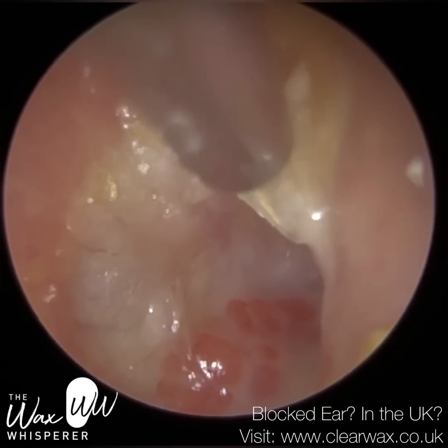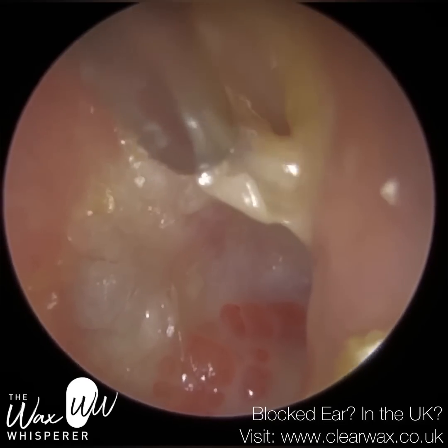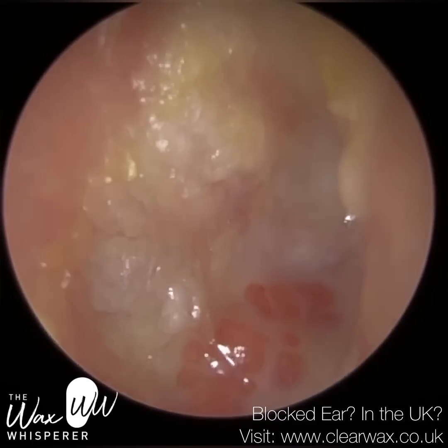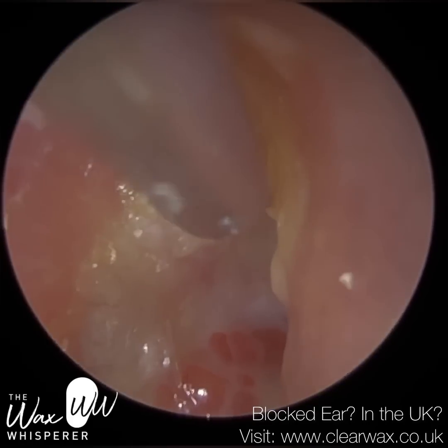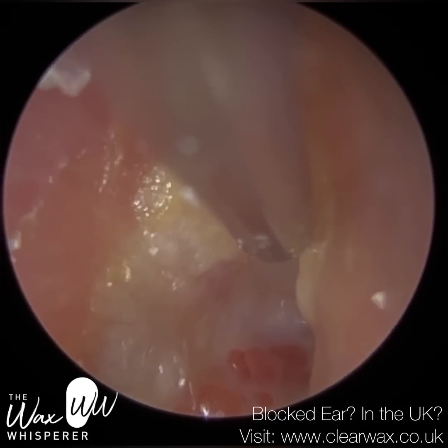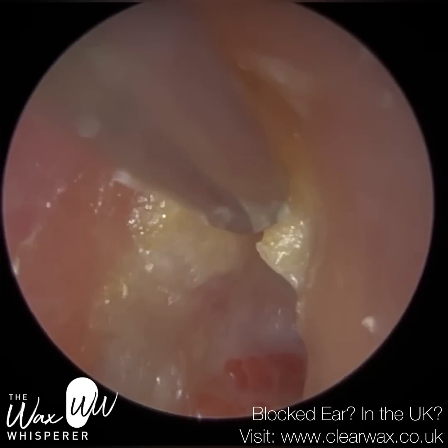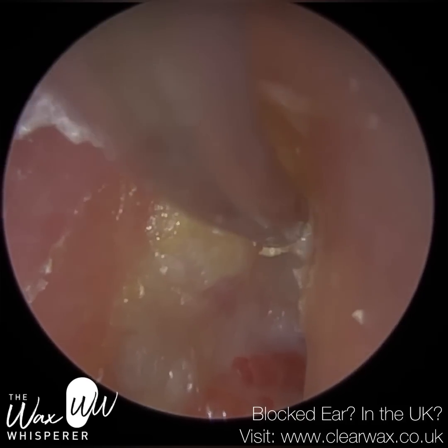So that granular myringitis is mainly affecting what we call the inferior quadrant, the south, if you're looking at a compass, the southern hemisphere. It looks slightly bulged there as well. So there might be some middle ear pathology involvement as well. So the plan of action is written to this patient's GP. I'm going to follow them up, and if there's no improvement after the medication, we're going to get an ENT referral requested for further investigation and treatment.